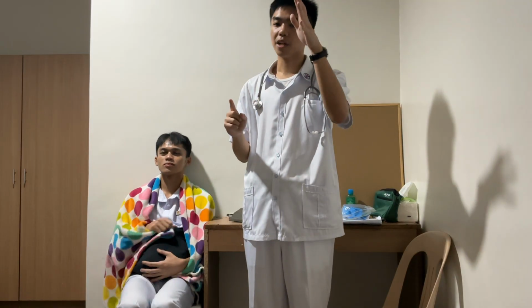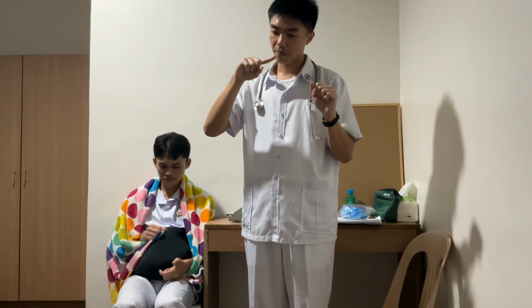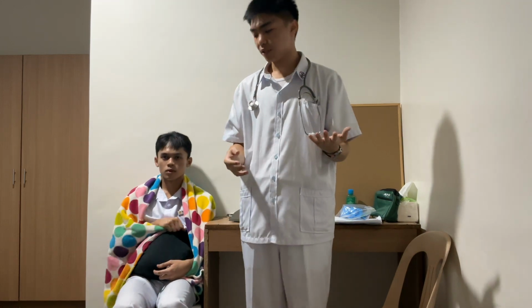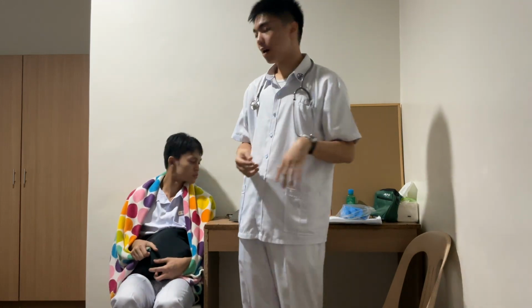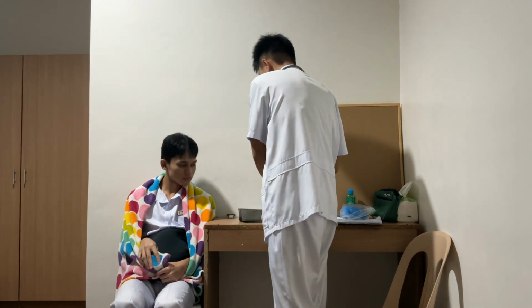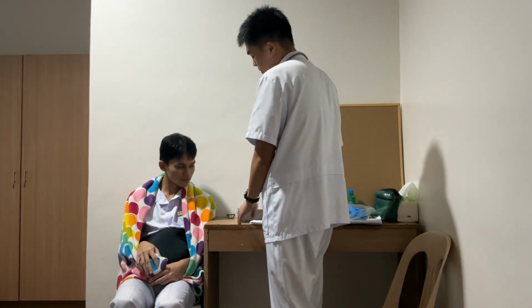So pop, first pop, that is the first systolic pressure, then until the last faint sound. The last faint sound is Korotkoff phase 5. So that is the last one, and then pop, then done. That is the diastolic pressure. So upon hearing now, ma'am, your blood pressure is 110/70. So that is actually normal.